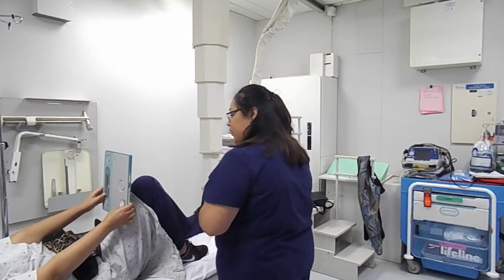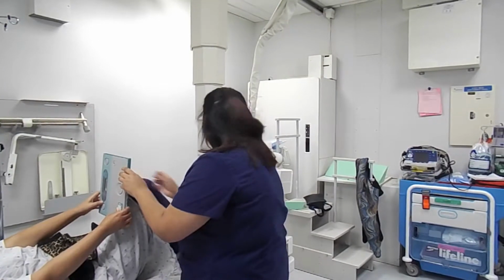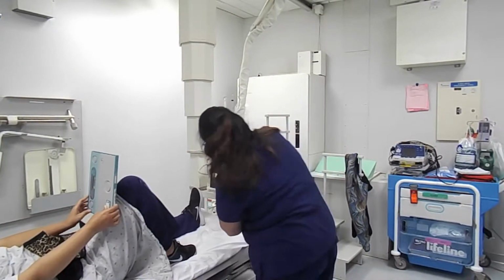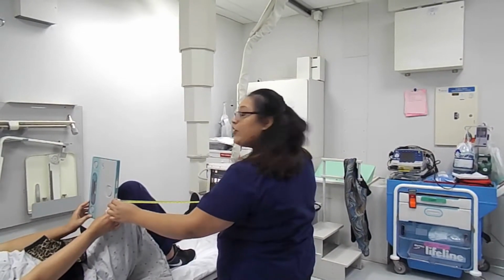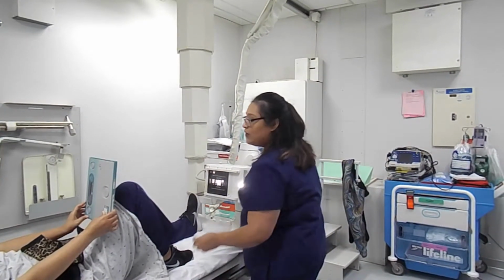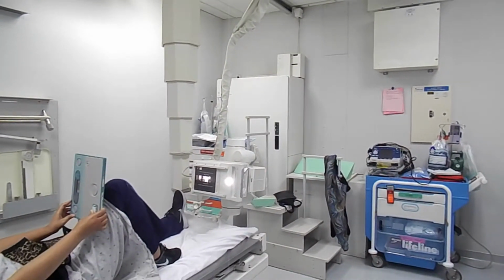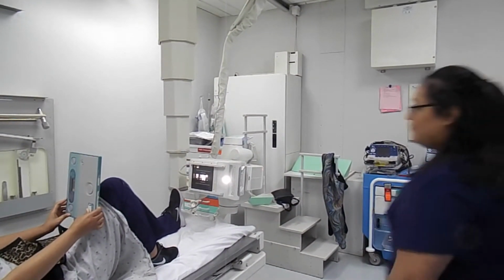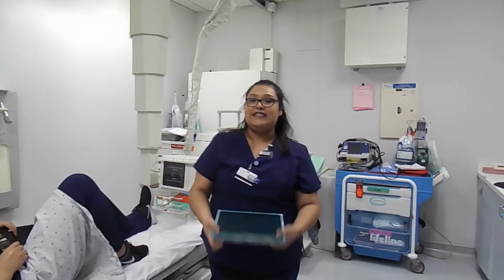Looks good. And marking my image. And just making sure that we're at a good distance as well. Right, good, 40. Okay, hold on still. X-ray. Okay, and we're going to be reading the image. So that completes our knee.